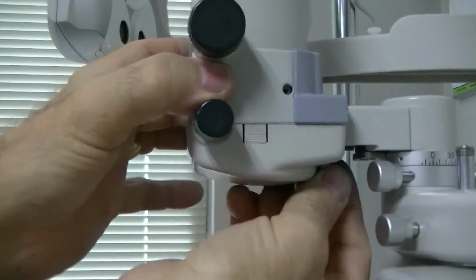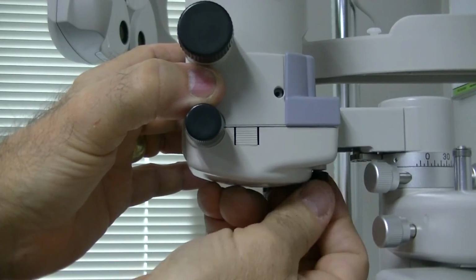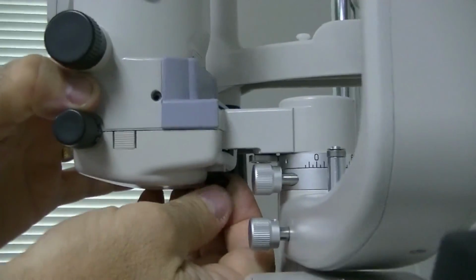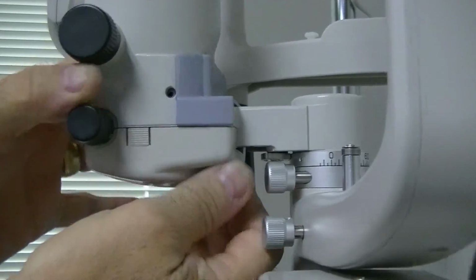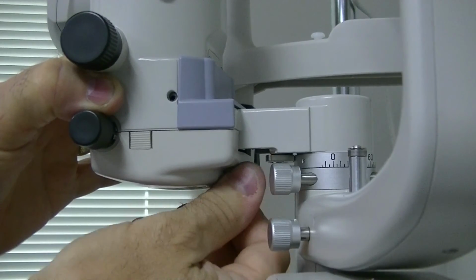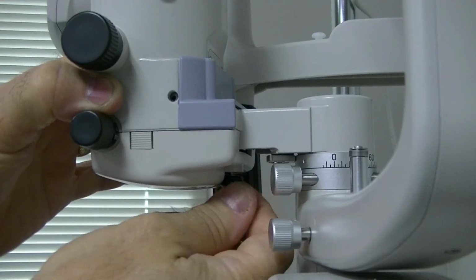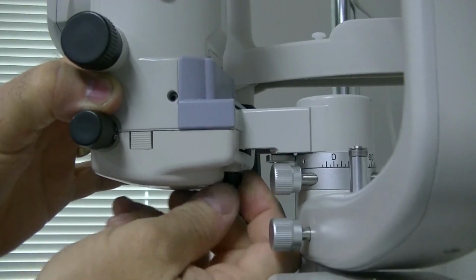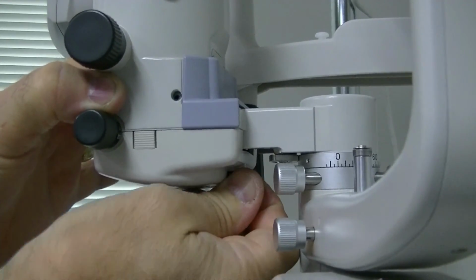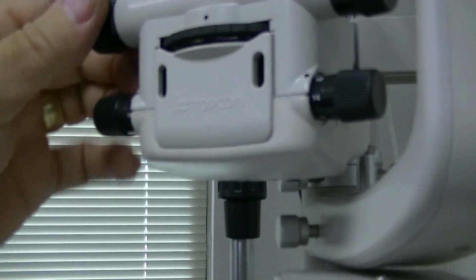Then you go ahead and screw this screw straight up back inside the threaded hole. And I can't get it to go. They said it's not that easy. They don't make it that easy. There it goes. Right up there, and just tighten it down, finger tight, and then your bulb replacement is done. And then your slit lamp will work after that.